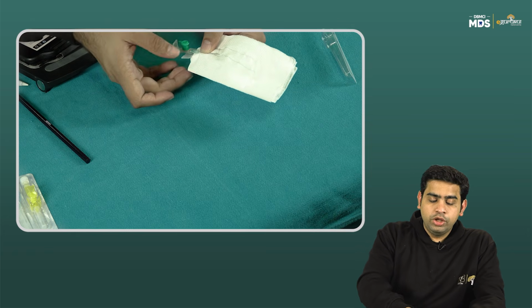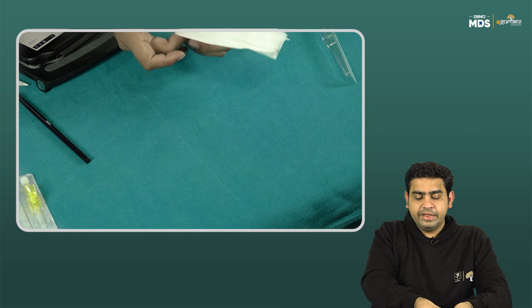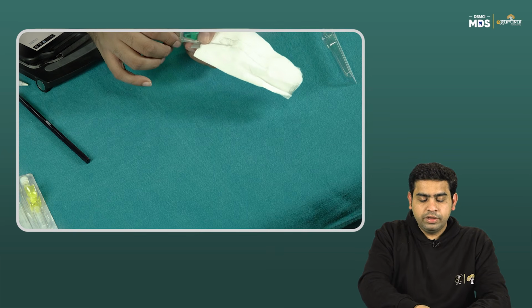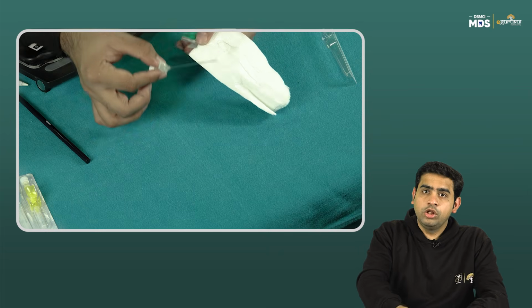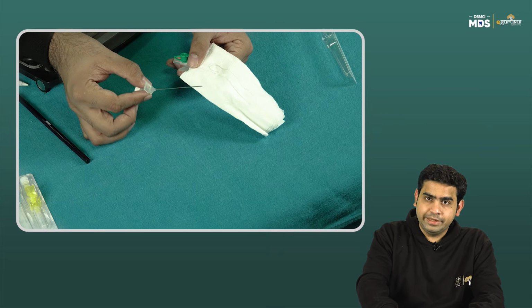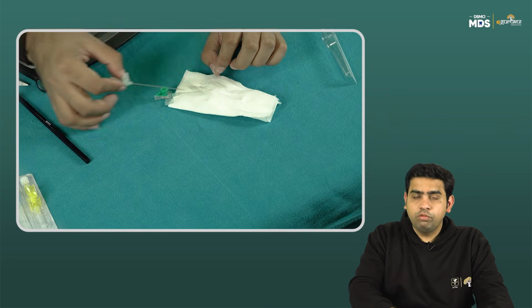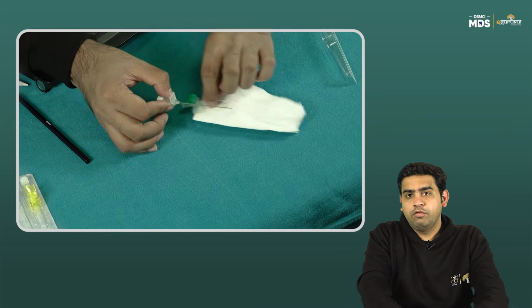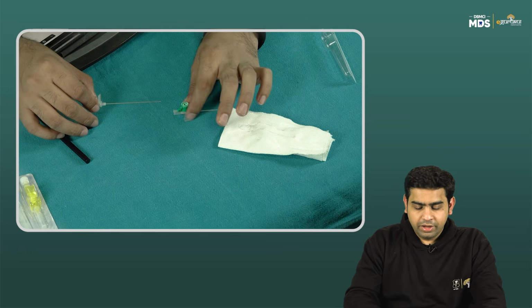Now you compress the vessel distally and then you remove this metallic needle from that particular cannula. So this is how you insert a cannula.